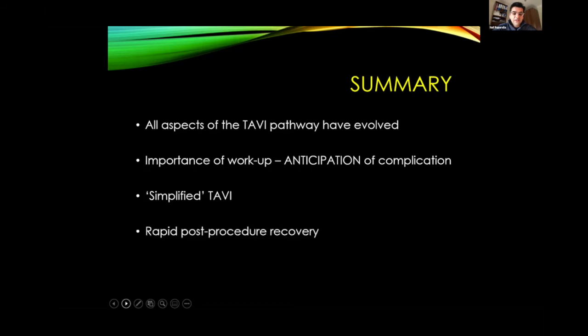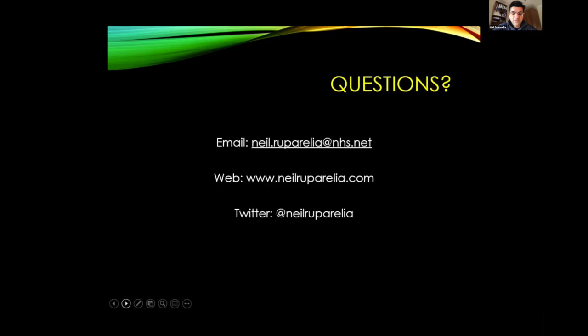So in summary, all aspects of the TAVI pathway have evolved. It's important to anticipate a complication. We've really now slimmed down our procedure to have a sort of simplified TAVI protocol. Patients are mobilized quickly and are discharged very soon, routinely 1 to 2 days, but there are certain patients where, if you proceed early in the morning, they can be discharged the same day. Thank you.